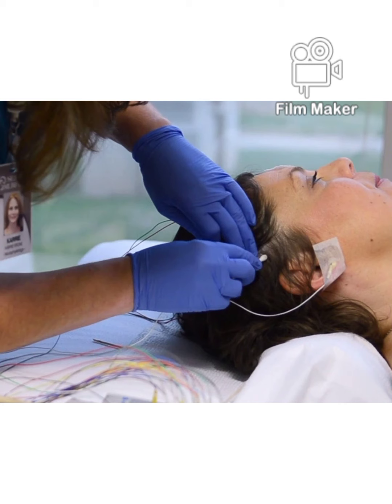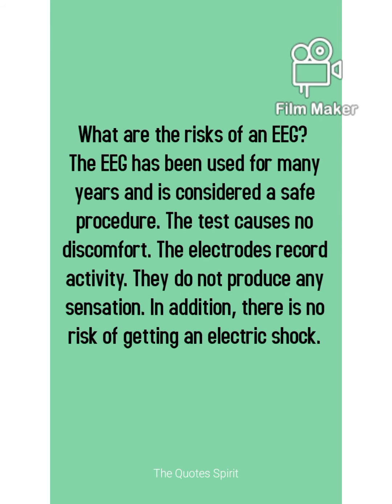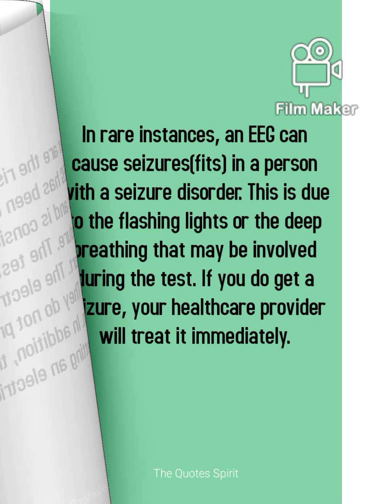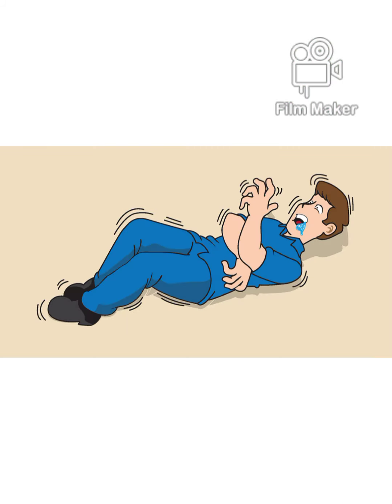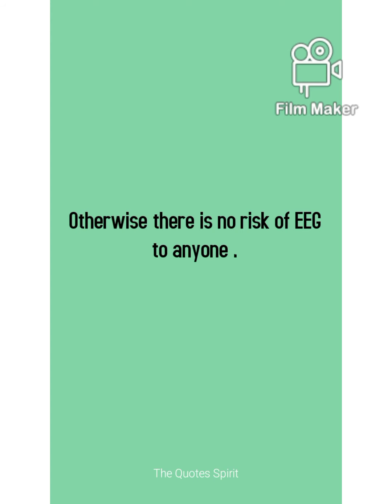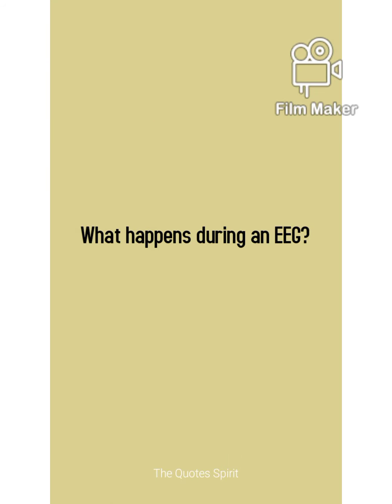Now here comes a question: what are the risks of the EEG test? What are the risks of the electroencephalogram test if someone is taking it? The EEG has been used for many years by many psychologists and psychiatrists and is considered a very safe procedure. There is no problem in giving the EEG test to any patient. The test causes no discomfort and no distress. In rare instances, an EEG can cause seizures, like fits, in a person with a seizure disorder. Otherwise, it doesn't have any risk to anyone.